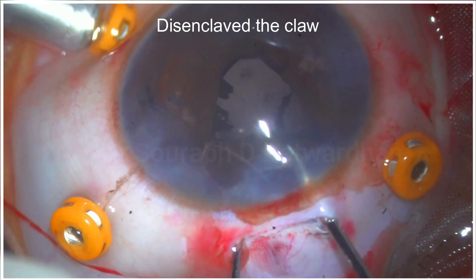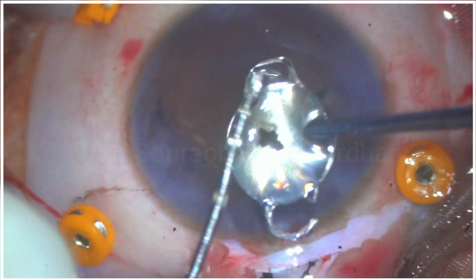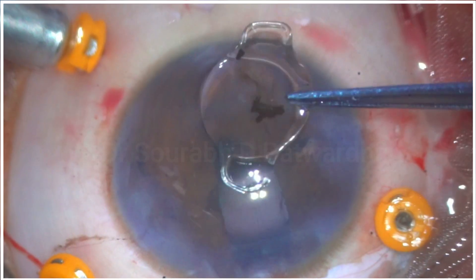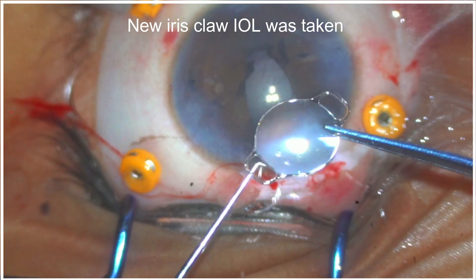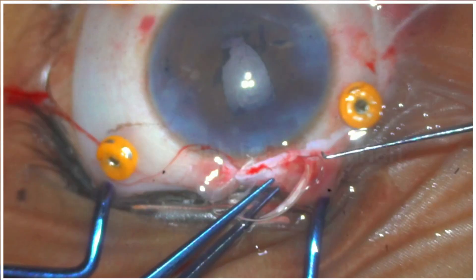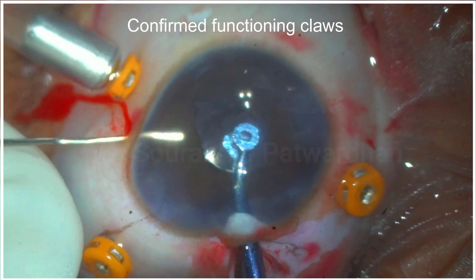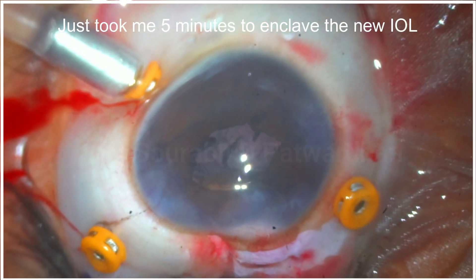I had to carefully dis-enclave this iris claw IOL from one side. I was surprised how it had enclavated into the iris when there was no claw. What had happened was: on one side there was no claw, and on the other side there was a self-made claw — probably the force had broken the haptic and that part got enclavated, but it was not stable. So I decided to take a new iris claw IOL, confirmed the functioning claws, and then it was very easy — I could enclave this IOL in just five minutes.